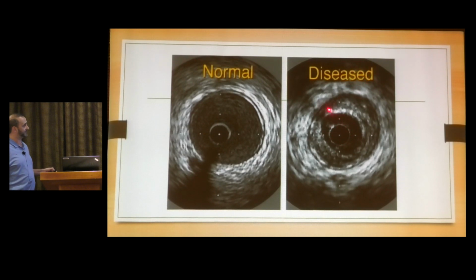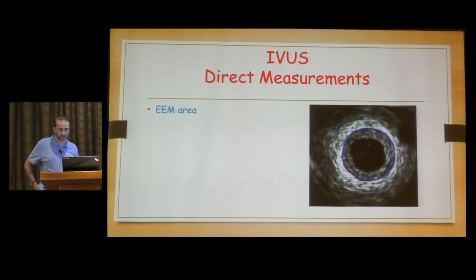This is obviously a diseased vessel. This is the catheter we have. This is the intima from here. This is very thickened intima. This is the media here. You can see there is a plaque here, maybe a small calcification in this area, very, very rich plaque here, fibrofatty plaque here. There is more here, soft plaque. We can see the lumen is more radiolucent than the other one.